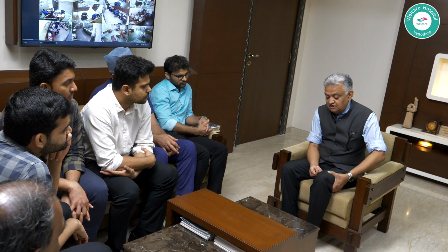So on table you will find once in a while that there is an external rotation contracture at the hip, which in the 90-degree position your assistant will have to struggle to bring that femur, have the medial condyle touch on the tibial cut surface, down like this.